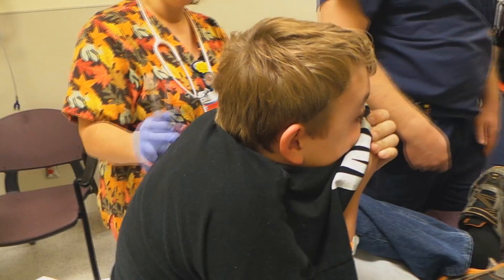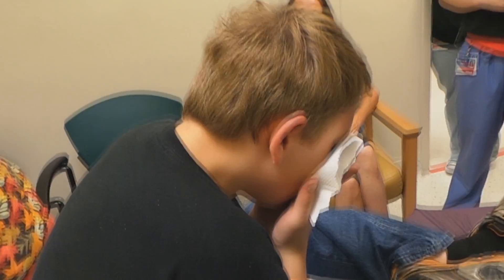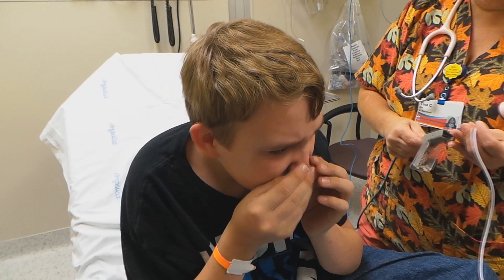What's it taste like? Oh — yucky, huh? Can I put this on your finger? A little bit on your finger? You did good. It's just like a flashlight. It takes your heartbeat — I think you've had it before. It's going to monitor your heartbeat. It's like a bandaid on your thumb or finger — you can wrap it around your finger. Show me which finger. There we go.